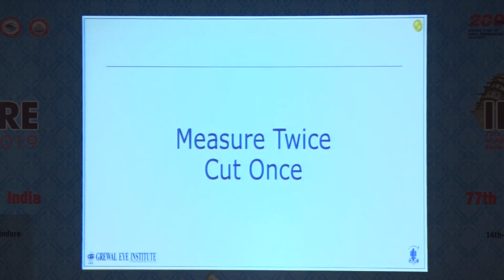Most cases who will present with ectasia will be cases that were borderline on topography but were missed in the preoperative evaluation. It is very important to repeat the test wherever you have any, even a low index of suspicion. Confirm before you proceed.